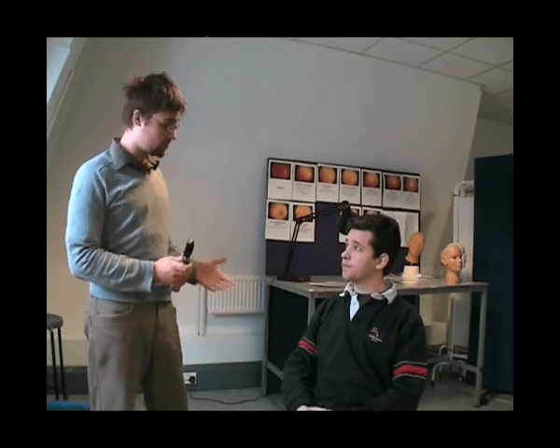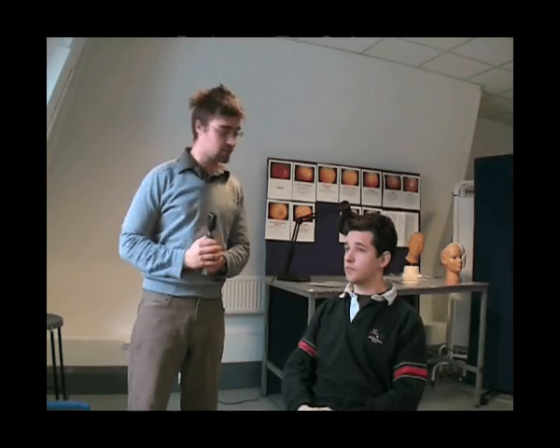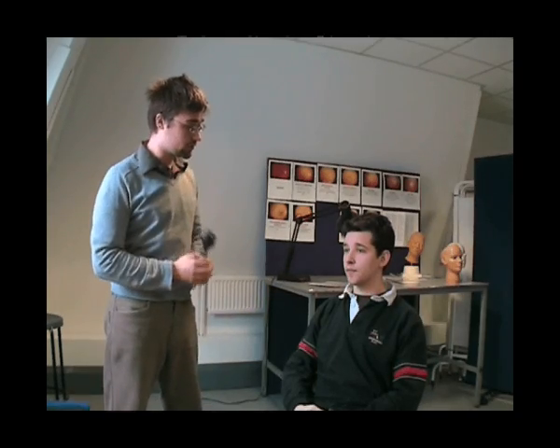Also, before we start, we make sure the patient is comfortable. And you tell the patient to look straight ahead into the distance. My head might come in the way of your vision, but can you please focus as far as you can into the distance?